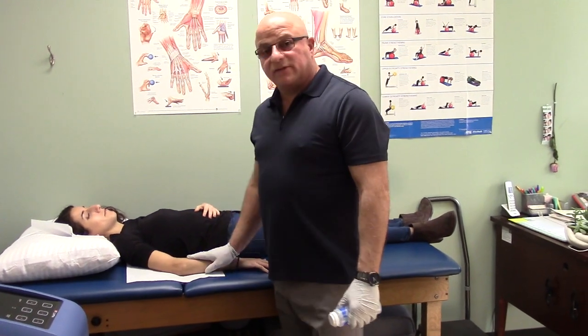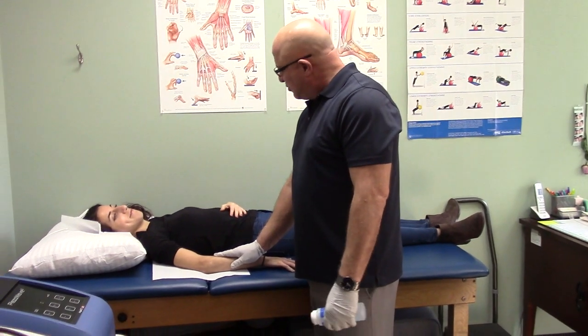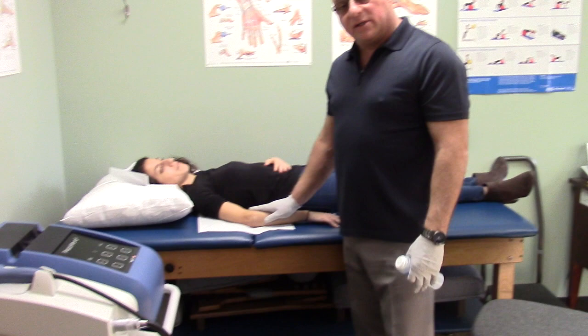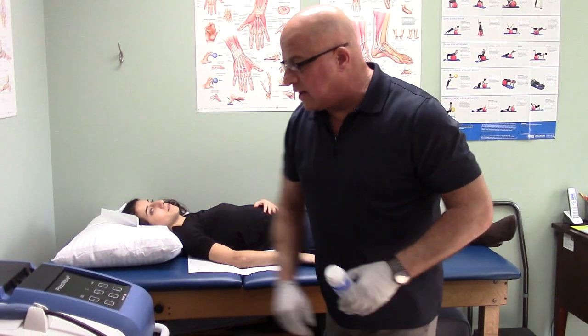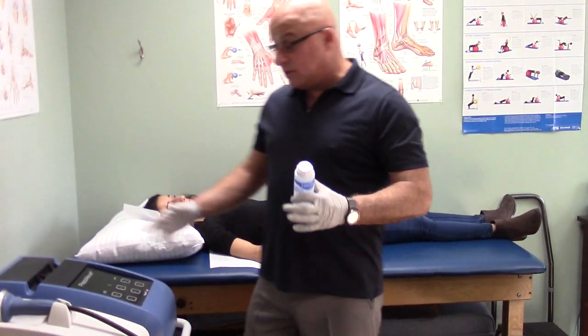We have my assistant Natasha here and she's going to help us with demonstrating how the shockwave works. She has a tennis elbow condition that I'm going to be utilizing the shockwave to treat. It's been one of the treatments we've done on her, and so far it's been pretty successful. I'm going to demonstrate what we do.